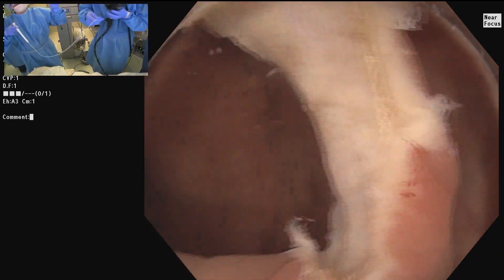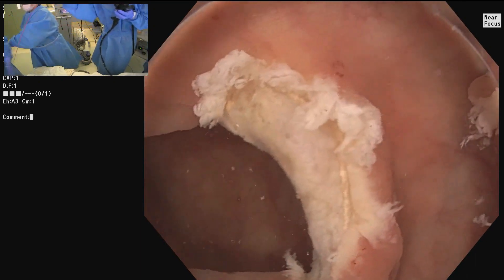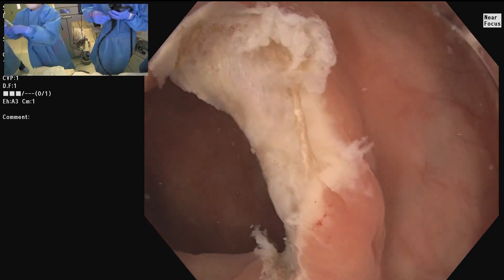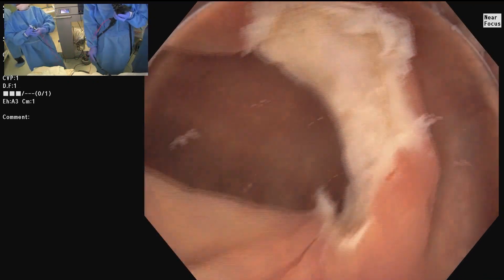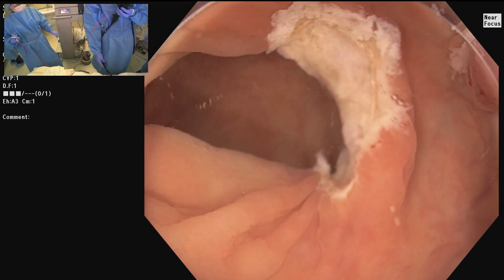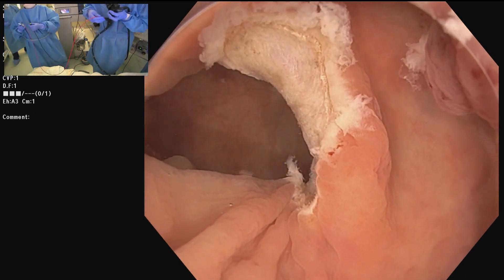Taking the NBI off, you can see as we take the snare out. I'm going to close this lesion, but first I'll get some biopsies. For these biopsies you can do it underwater or with gas — let's just put the gas on so we can see how it looks. What's the biopsy for?